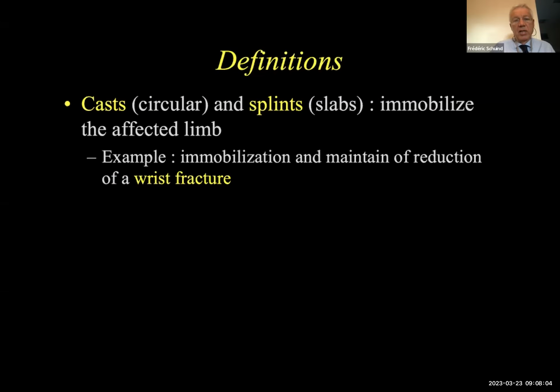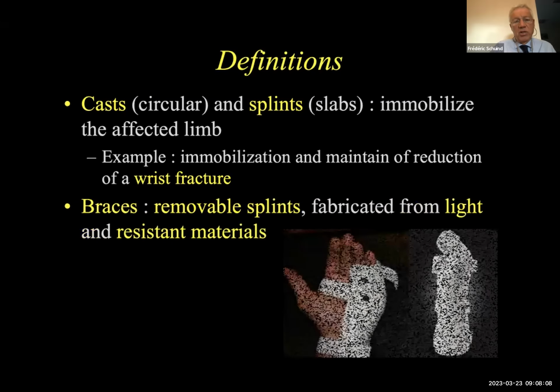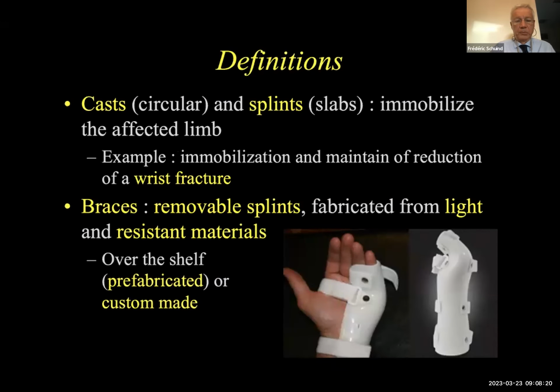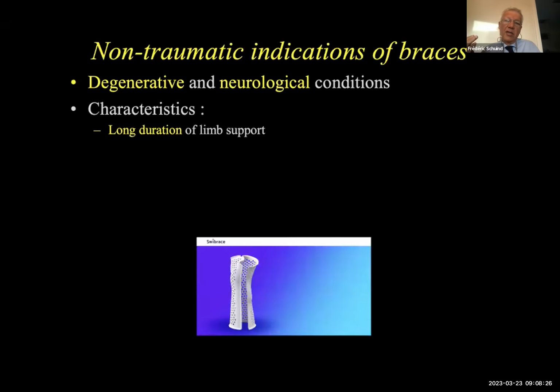Casts and splints immobilize the affected extremity, for example, the distal radius fracture, and braces are removable splints fabricated from light and resistant material. And this is the place where we can bring 3D printing. Slide, please. So I will start with the non-traumatic indications of braces.